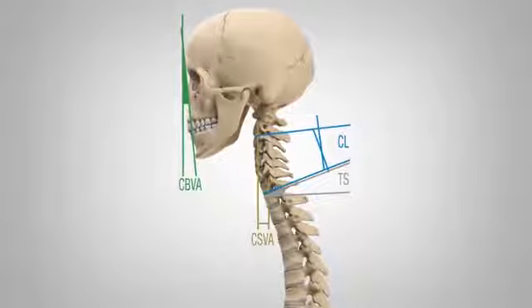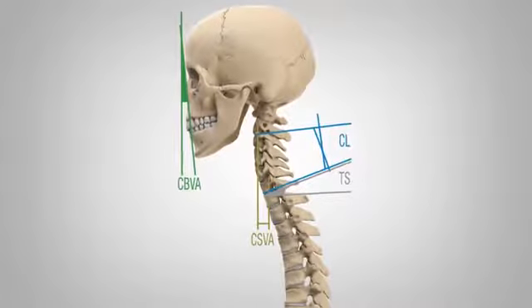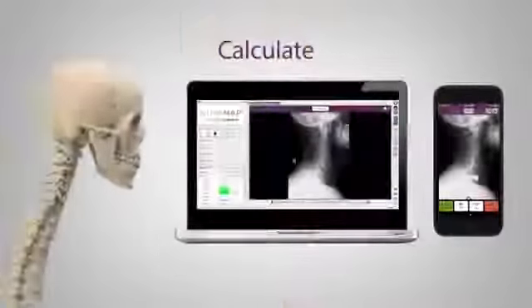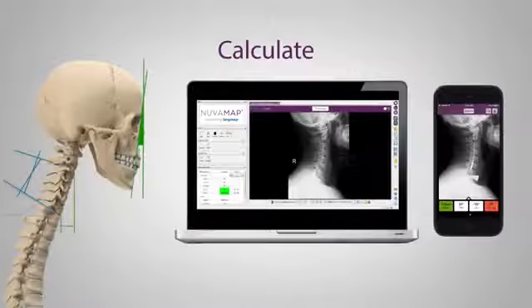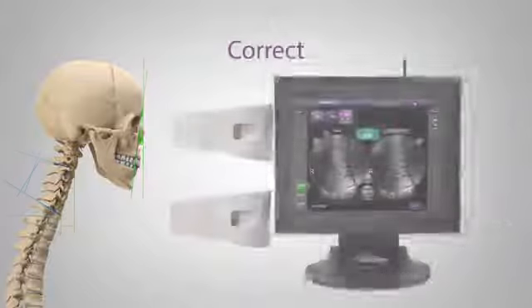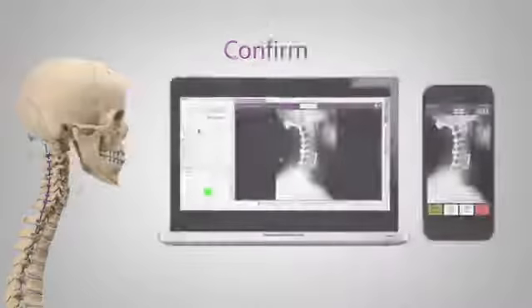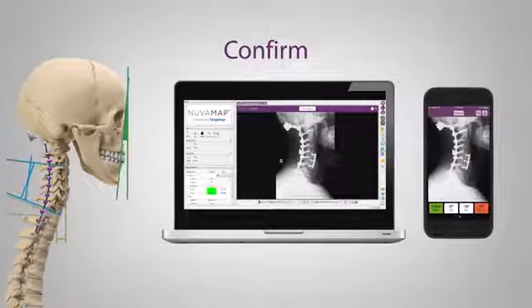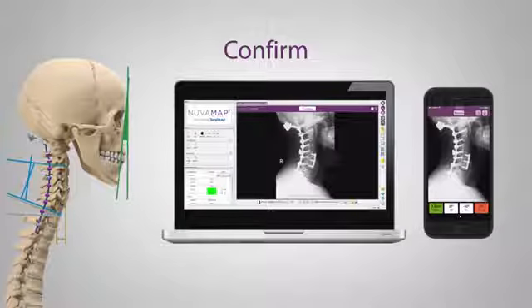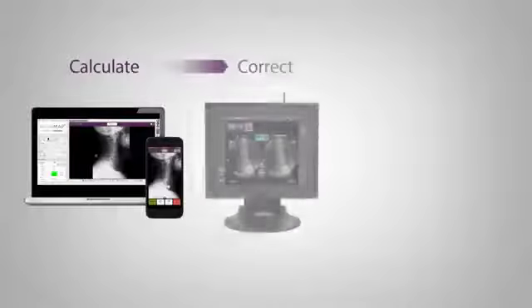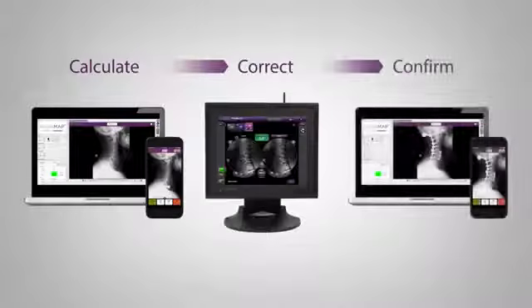And now, for the first time ever, you can calculate, correct, and confirm a patient's alignment in the cervical spine across the entire surgical workflow with NuVasive's Integrated Global Alignment.